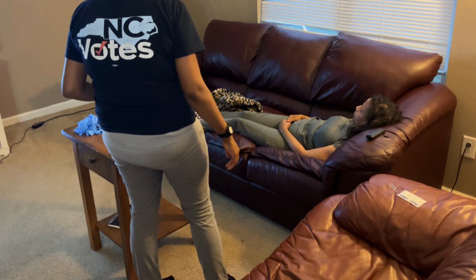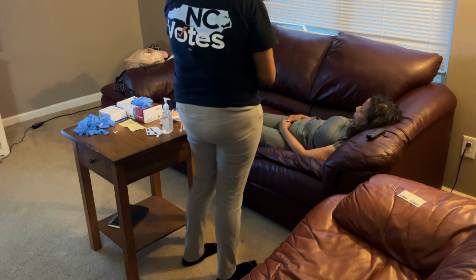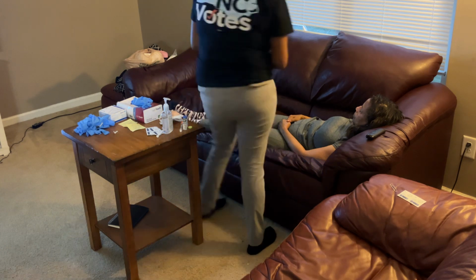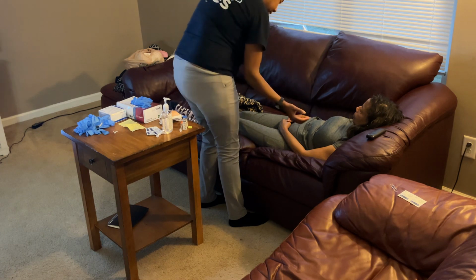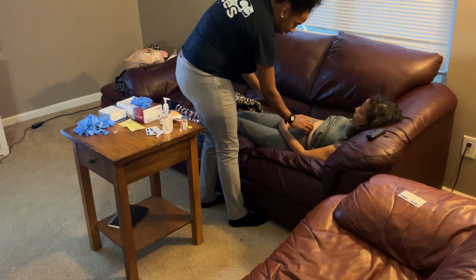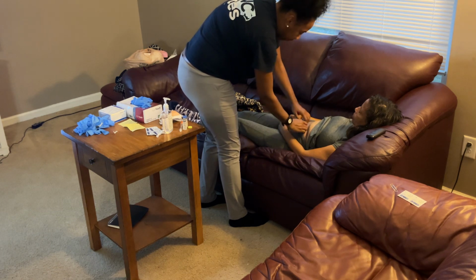And so now I'm going to make sure that my patient is elevated in a comfortable position for the injection. Right now the head is elevated and the patient's sitting up. Could you please lay down? Okay, patient is actually laying down, I'm sorry. Patient is laying down so that I can palpate the area. All right, palpate the area. Don't feel any distension, it feels fine.